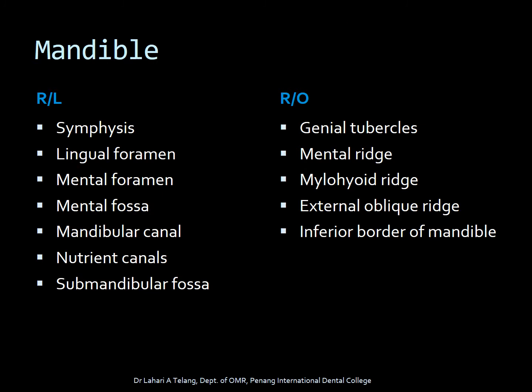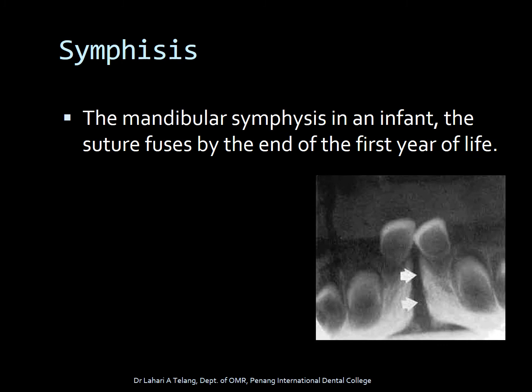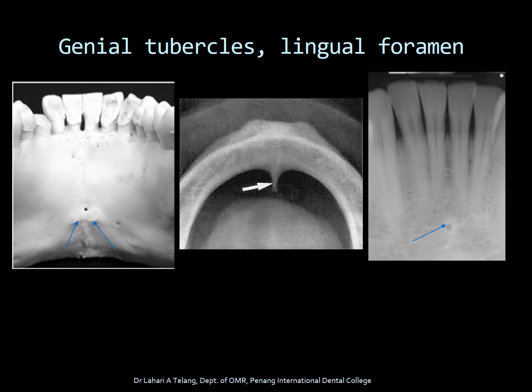The mandible also has important radiolucent and radiopaque anatomical landmarks. The symphysis is generally only seen in infants — it is the suture which fuses at the end of the first year of life. The genial tubercles are a radiopaque structure seen on the lingual surface of the mandible, prominently visible in an edentulous arch. The lingual foramen seen here is evident in only a certain portion of the population, not everyone.